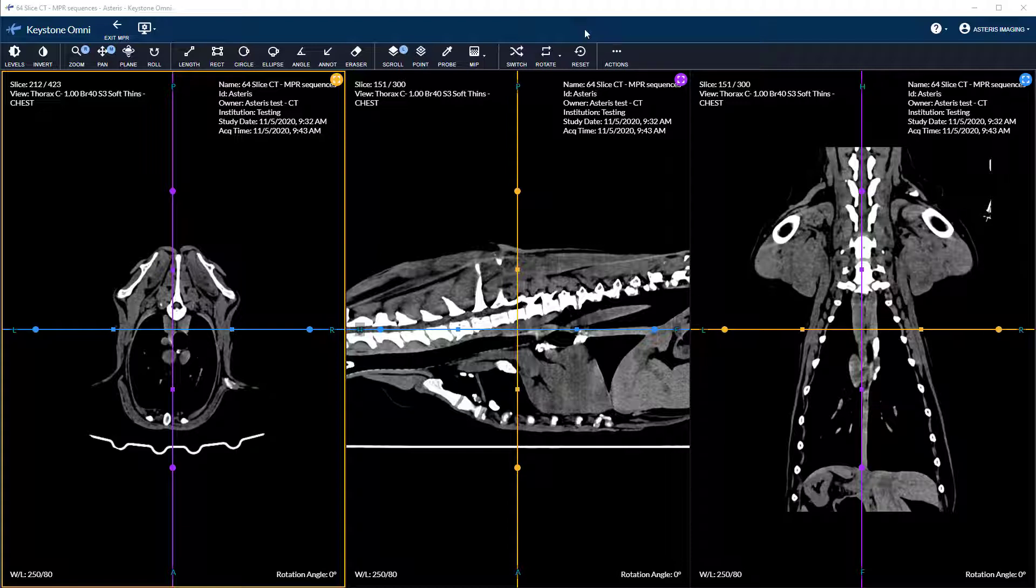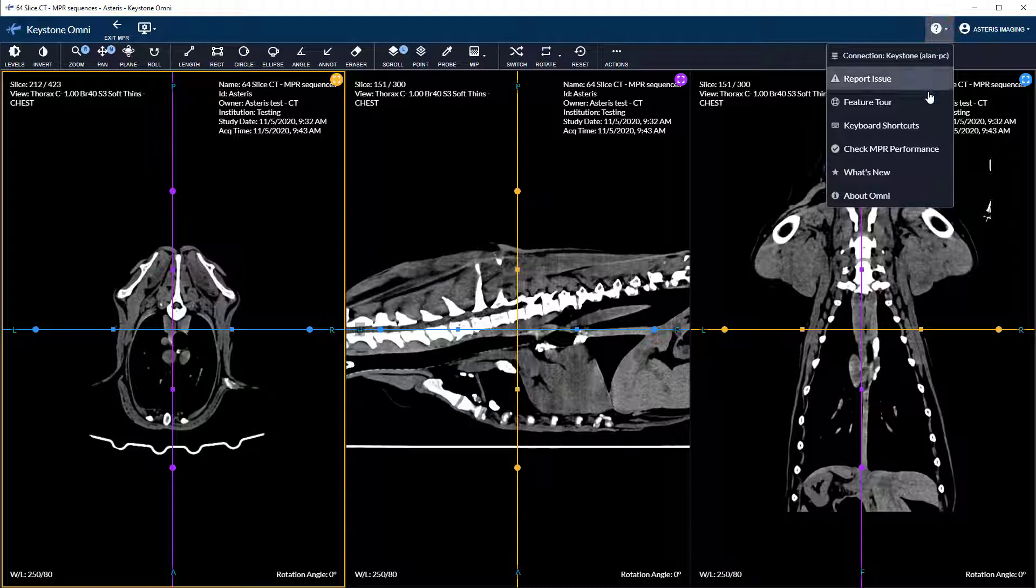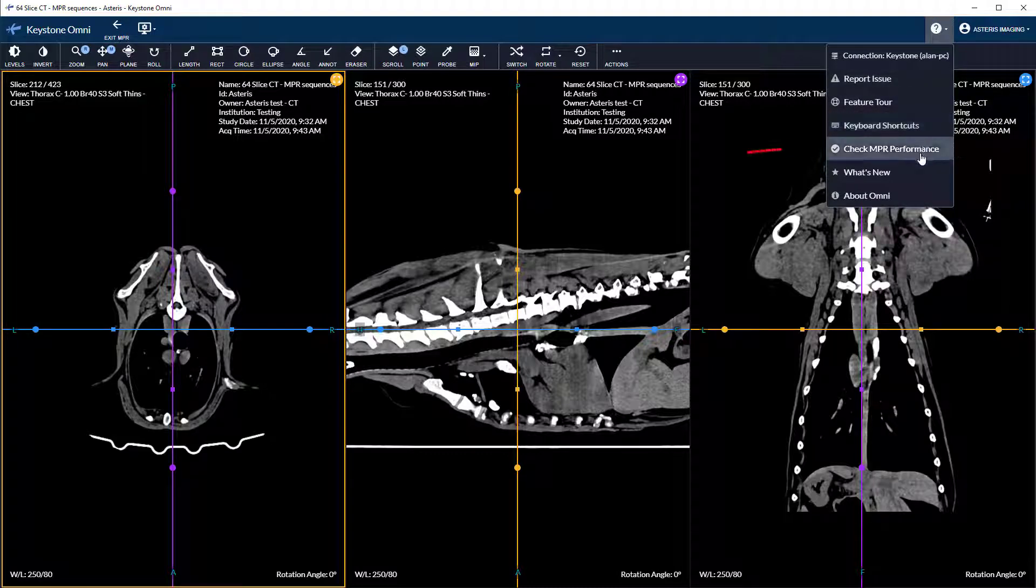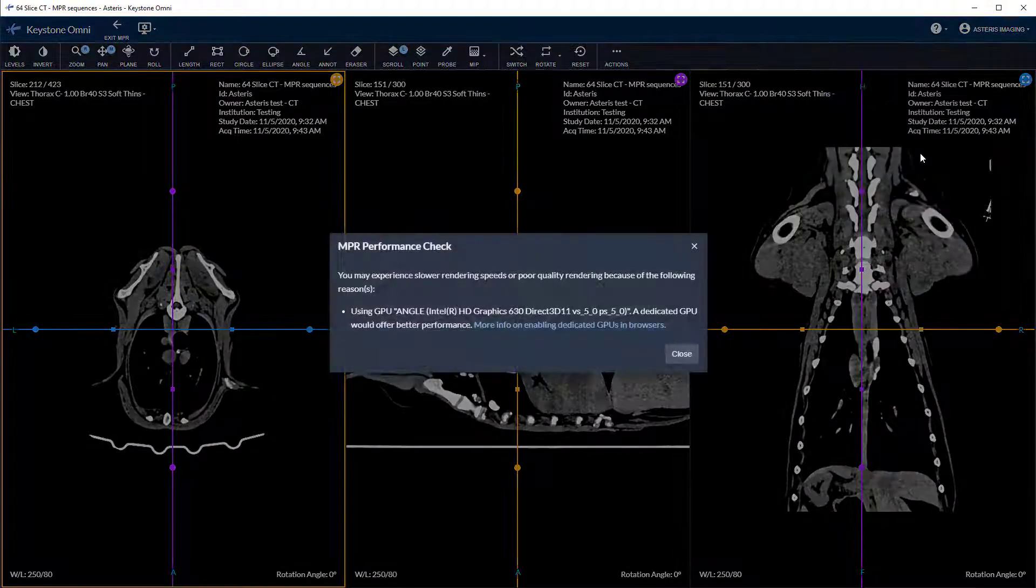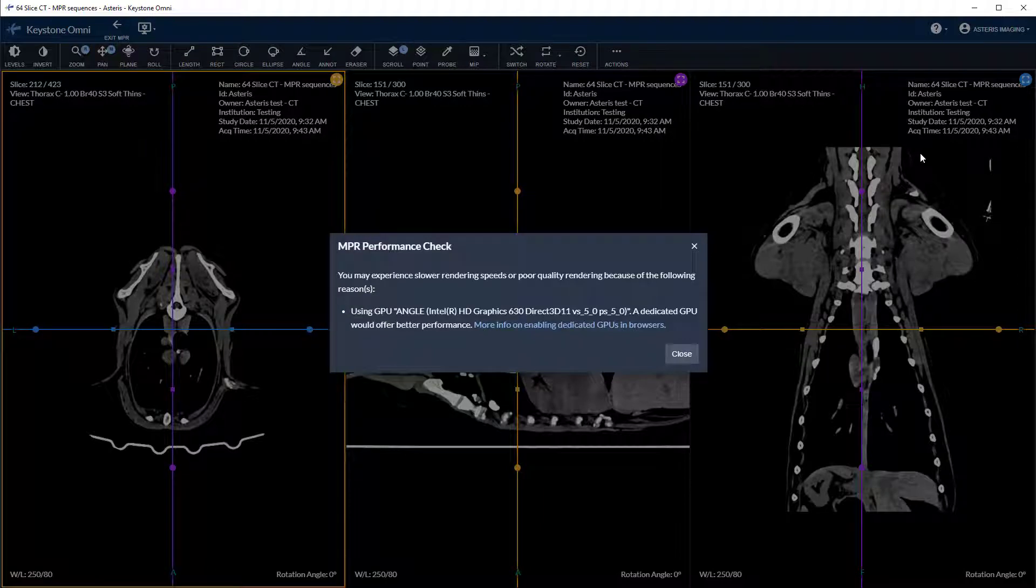You can check your MPR performance by clicking the question mark at the top right of the viewing window. Several options will be available including check MPR performance. This tool will notify you of any shortfalls on drivers, memory, and graphics processing.